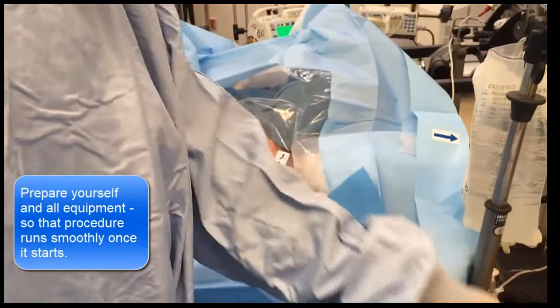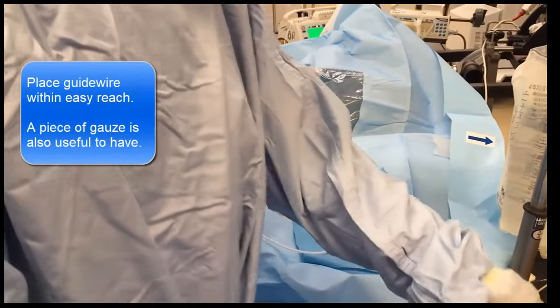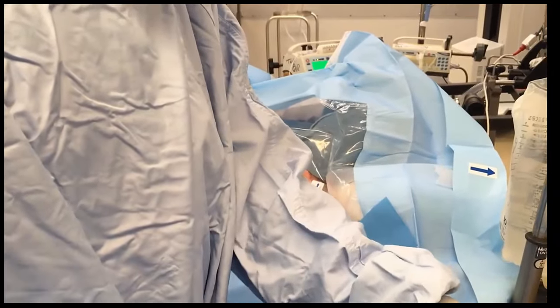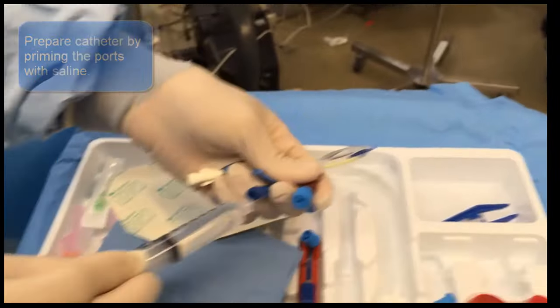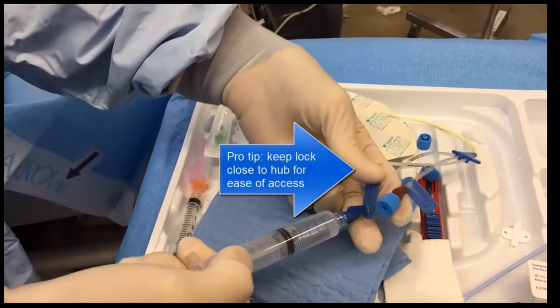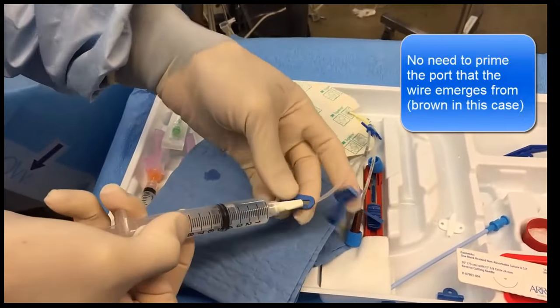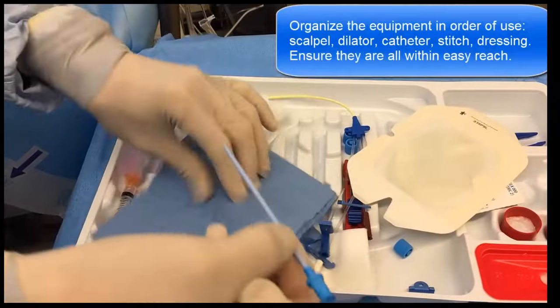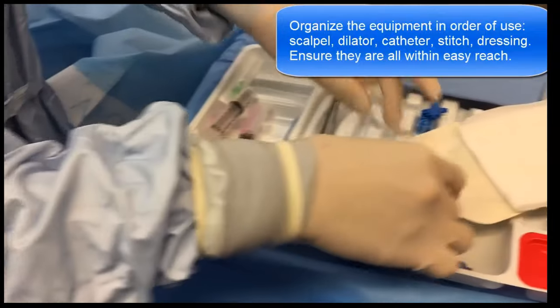Prepare all the essential equipment: a long introducer needle, 6 cm or so, mounted on the syringe; a guide wire with the J-tip retracted, ready for insertion into the needle hub; and a piece of gauze handy for mopping up blood. Then prime all the ports of the catheter with saline except the one through which the wire will exit — the brown port in this particular catheter model. There is no point priming or locking this port as the wire will come out from the end anyway. The dilator and scalpel for stab incision of skin should be placed within easy reach.